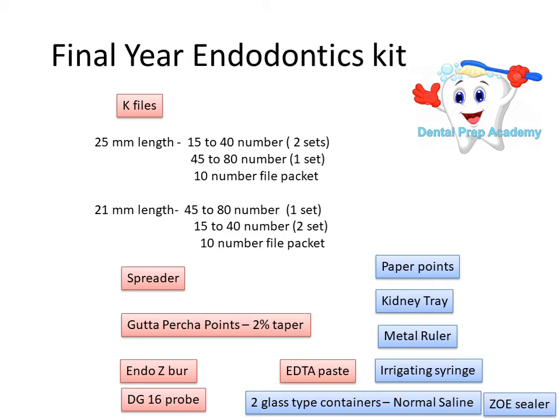So chlorhexidine is basically used in retreatment cases, and sodium hypochlorite is also there. What it does is, it is basically a pulp solvent or soft tissue solvent, sodium hypochlorite. It can be available in various concentrations. 5.25 is its highest concentration.